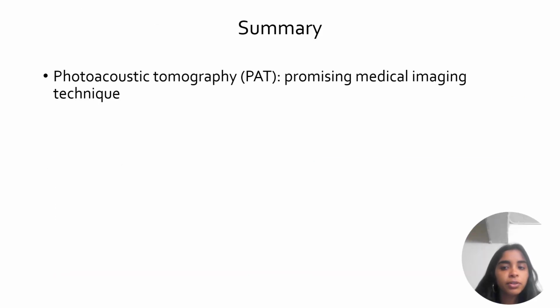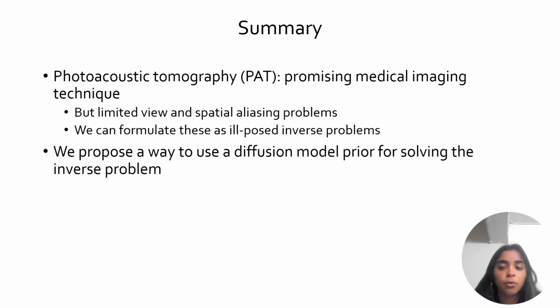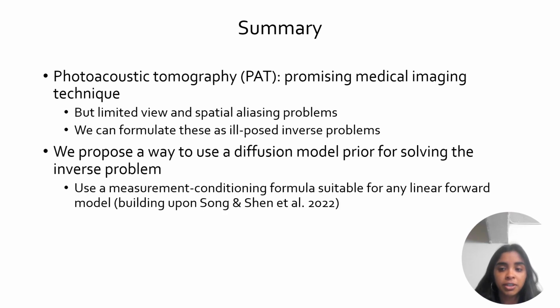To summarize, photoacoustic tomography is a promising, relatively safe medical imaging technique. But image reconstruction becomes ill-posed in the limited view and spatial aliasing measurement settings. We proposed a way to use a pre-trained diffusion model as a prior to do ill-posed PAT image reconstruction. The key to the method is a measurement conditioning formula that's used throughout the sampling process of the diffusion model. That formula, unlike that of Song and Shen et al., works with any linear forward model.